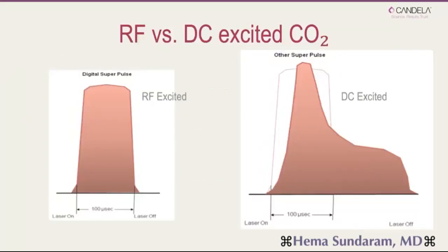And those of us who know the Candela technologies will know that a great many of them use radio frequency in one way or another. A radio frequency is a fantastic light energy. And in this case, the way it's being used is to excite, to switch on and switch off very precisely with the sharp rise in the peak of energy delivery and the sharp fall for this resurfacing laser.